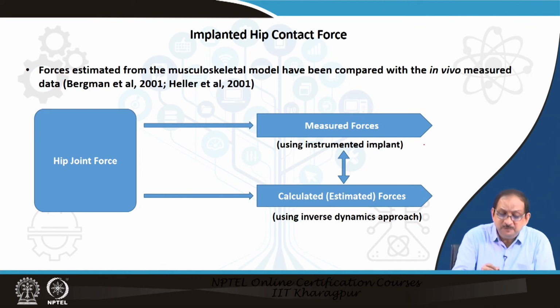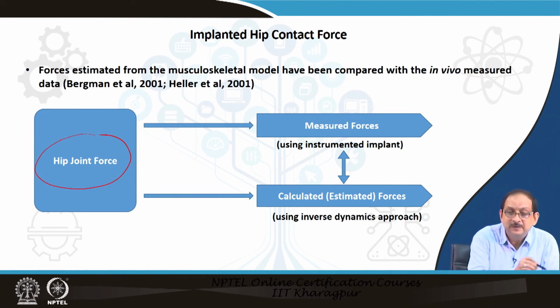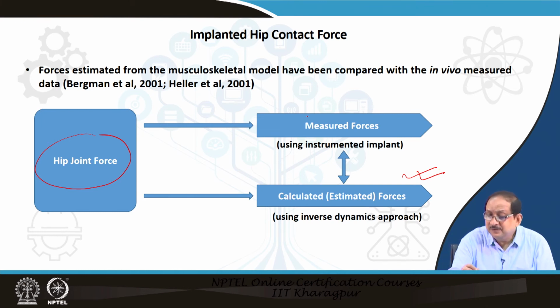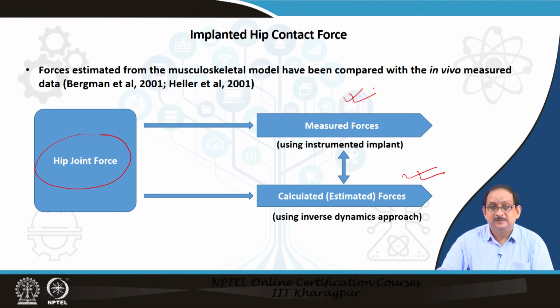Now, the hip joint reaction force or hip contact force can be calculated or estimated, and it can be measured using instrumented implants. So, these two are different procedures.